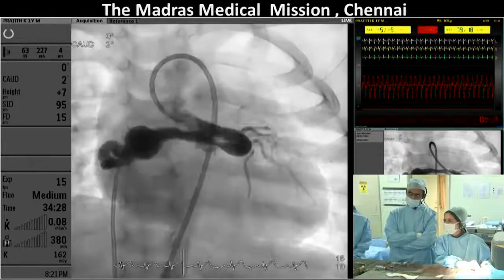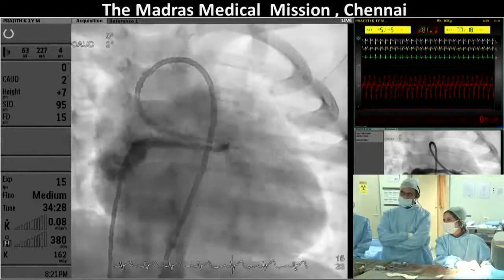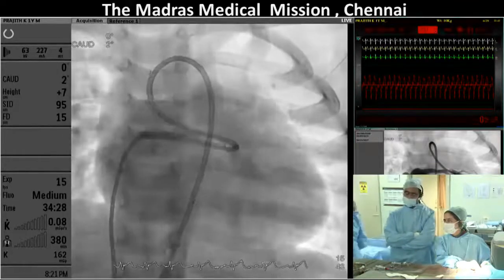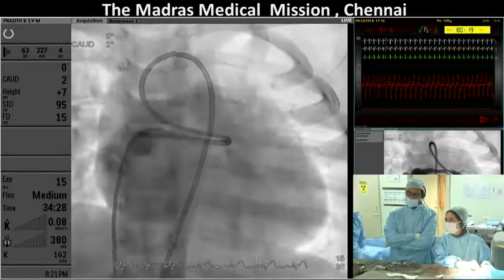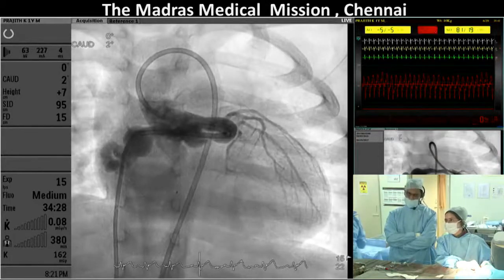I would make sure you could cross into the bigger hole, and then I would deliver either an AVP2 or ADO1 in that region, or you've got a choice of filling the aneurysm sac. So I would close this fistula at two ends. And then you would be sacrificing the sinoatrial artery. Yeah.